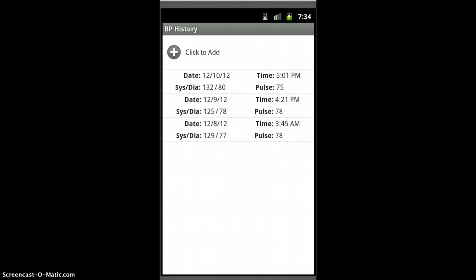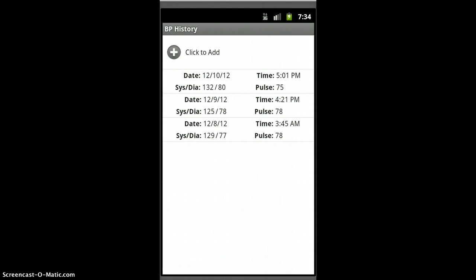Hi, this is a video update for BP Tracker version 1.3. I wanted to show you some of the features that are in the new version.